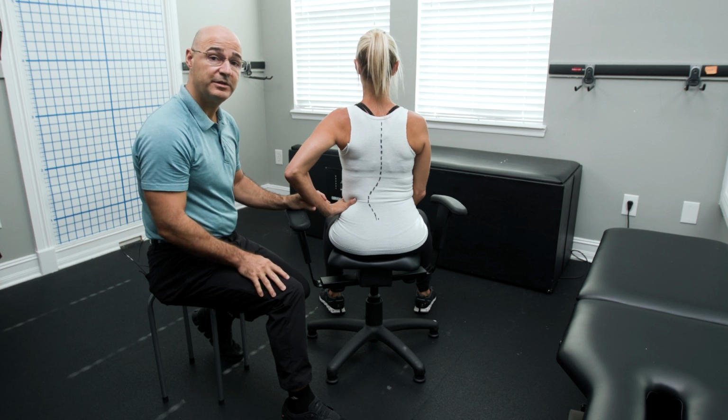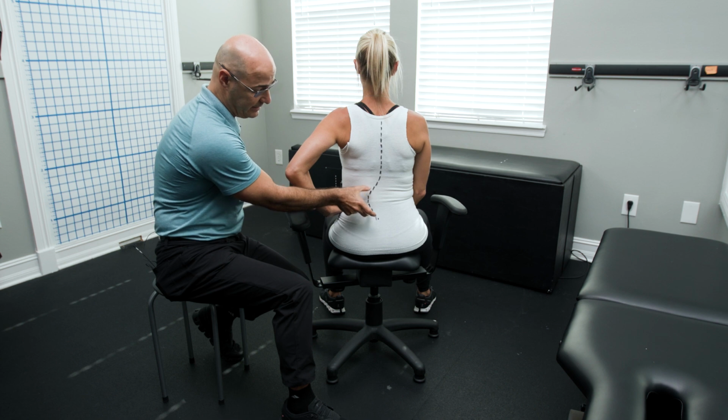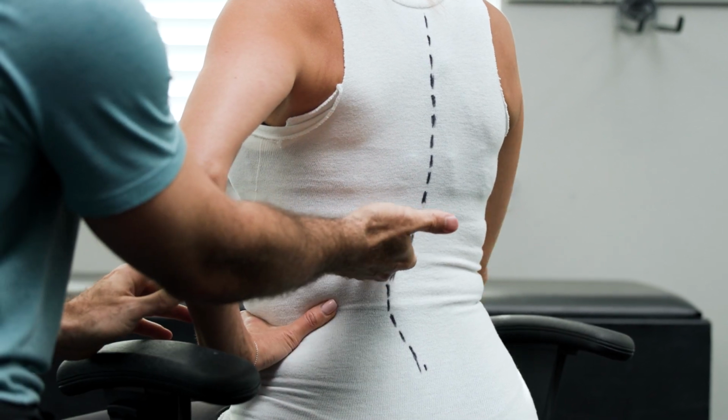This is a lumbar curve demonstration, and with the lumbar curve, we're trying to increase the flexibility of these disc tissues and try to unwedge them. So you can imagine the discs are wedged like this. We want to open up those disc tissues. So go ahead and perform the exercise, Tina.